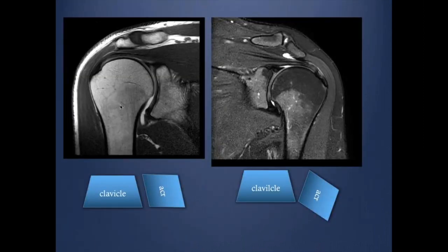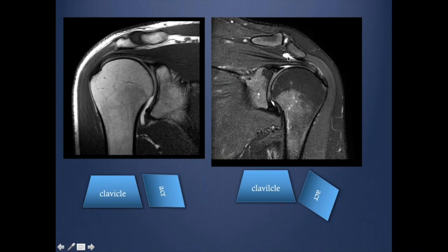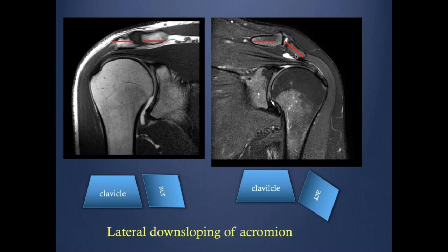Lateral downsloping of the acromion. If we look at the normal relation of the distal clavicle with the acromion, they are usually in the same line with no subluxation or angulation. If the acromion tilts more downward, this is what we call lateral downsloping of the acromion. This is usually congenital and can be seen even in asymptomatic patients, so I don't conclude it is causing impingement — rather I state the fact that lateral downsloping is present.